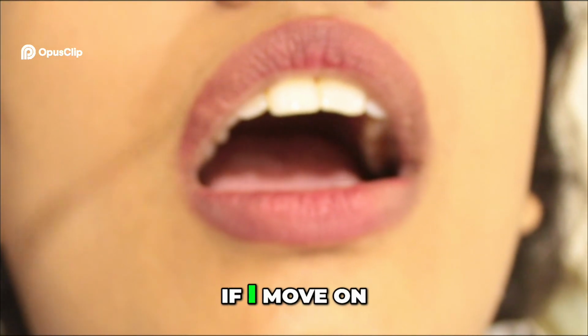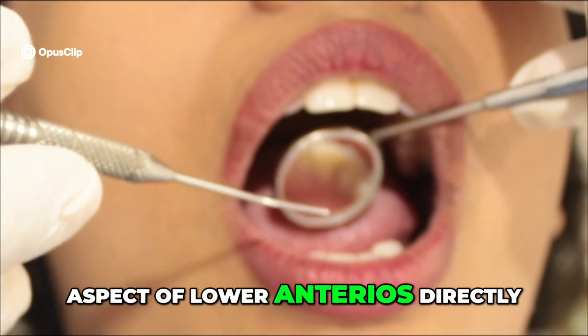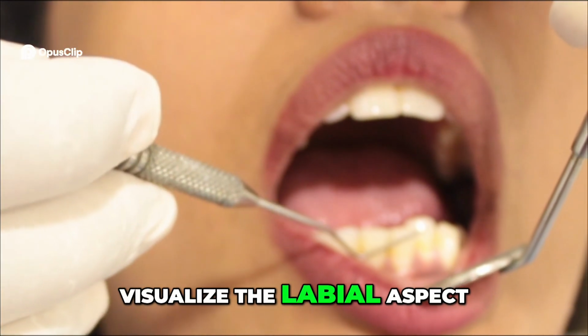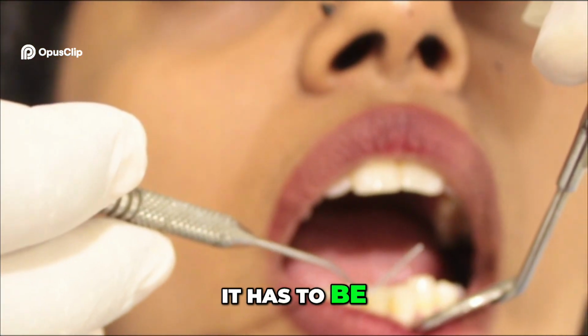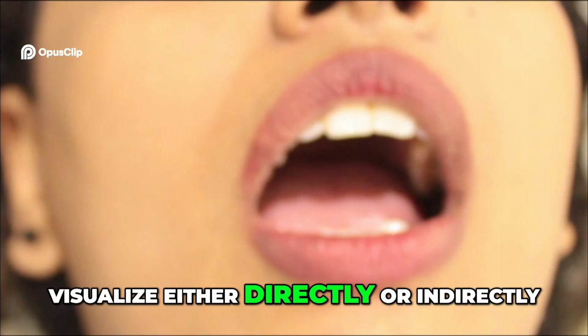For example, if I move on to the 12 o'clock position, I'll be able to see the lingual aspect of lower anteriors directly. Whereas if I have to visualize the labial aspect of lower anterior teeth from the 12 o'clock position, it has to be through the mouth mirror. So as per our convenience, we can change our position and try to visualize either directly or indirectly.